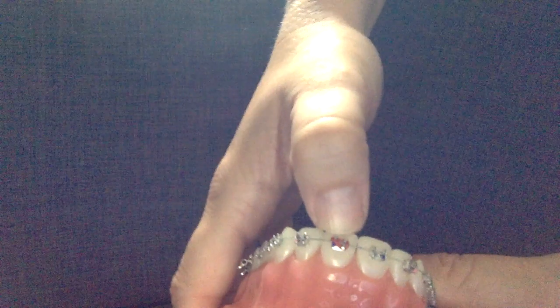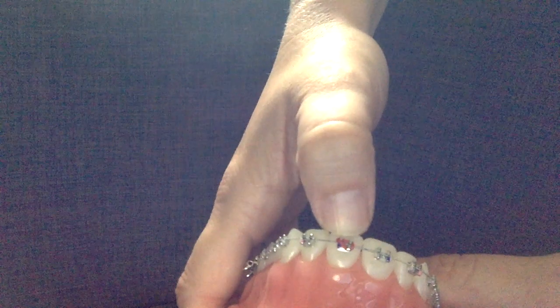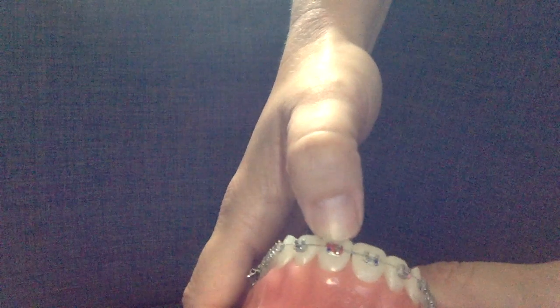Ligatures are meant to go on all four tie wings. Occasionally you can't get it around all four. Sometimes it's because there's some adhesive stuck under the wing, or some plaque, calculus, or food — but these things can be removed and cleaned out.